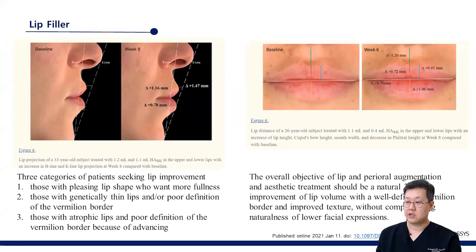And we will add some injectables. Usually, we will use different kinds of fillers, and today they will be used for lip shaping, because if you are changing the contours of the lips, we usually have different approaches for the perioral movement. So we will go for beautiful lips. You can see the standard of beauty is very standardized, but it should be customized to the patient's demand and the patient's taste.